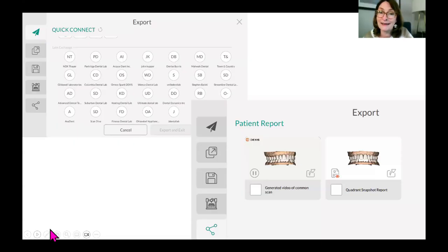And you could show them the scan, right? We didn't chip your tooth. As a matter of fact, let's take a peek, because I think this is so important for you to see. Do you see the scan that we have? It's not a chipped tooth. It's a wear facet. Remember how we asked you and we said we really need to get you a night guard? This is why. This is why.